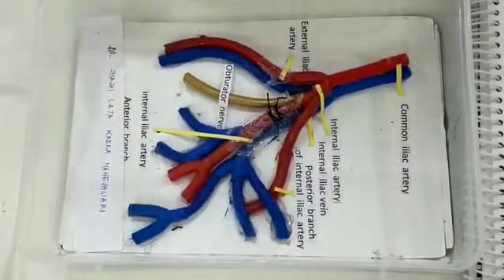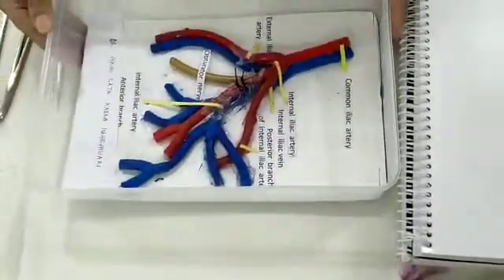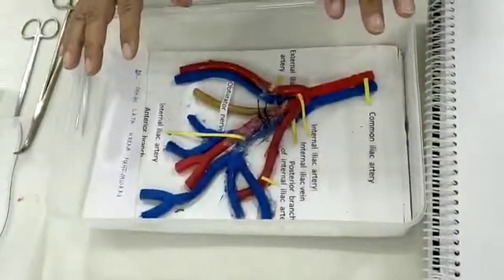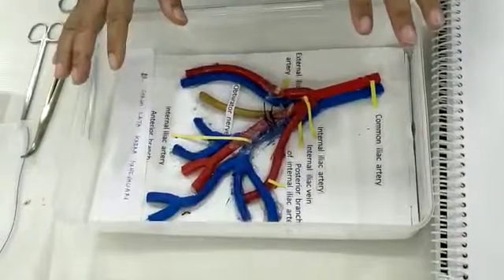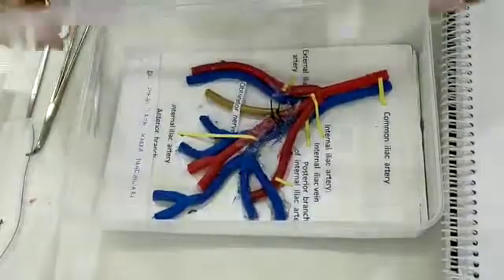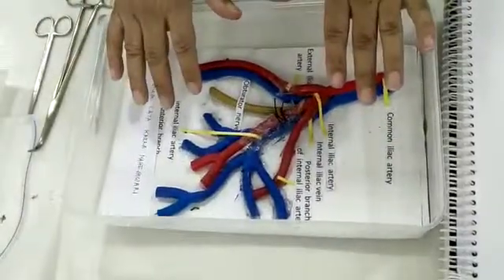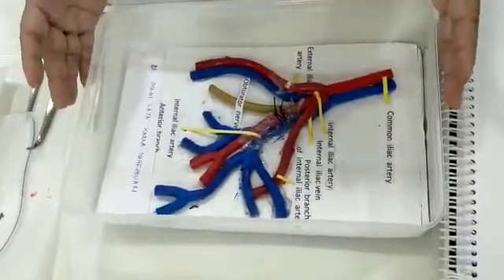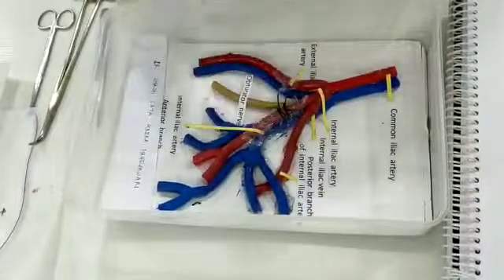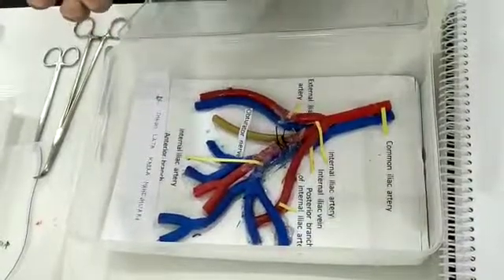Never make a pull on the artery. The design of the box I've made is almost five inches deep just to give an appearance that we have to work in depth. Internal iliac artery is a retroperitoneal structure and it is at depth. Consider this is the abdomen and this is the upper surface. While we are applying ligatures on the internal artery, we should not pull the threads toward the abdomen, because if you pull the threads the artery will get torn and there will be massive bleeding.